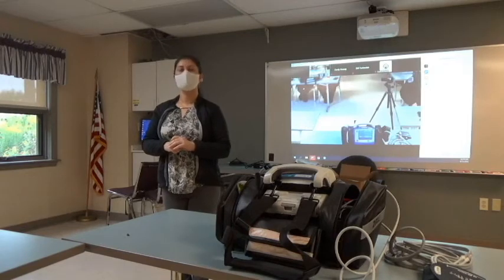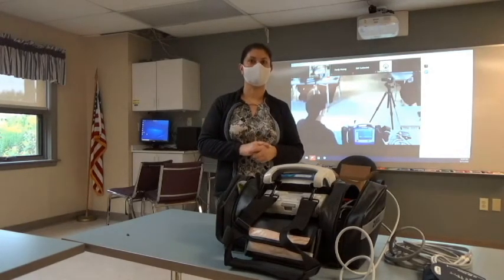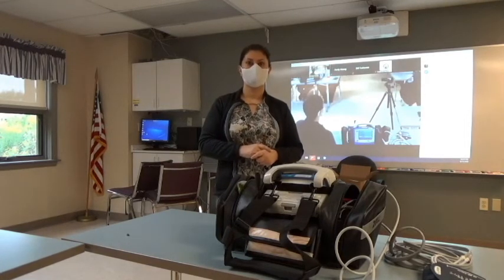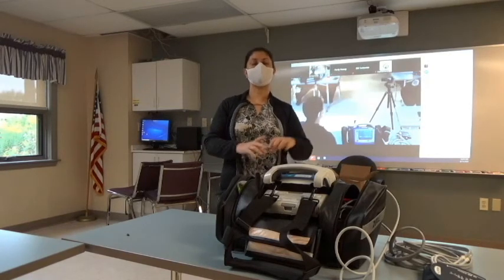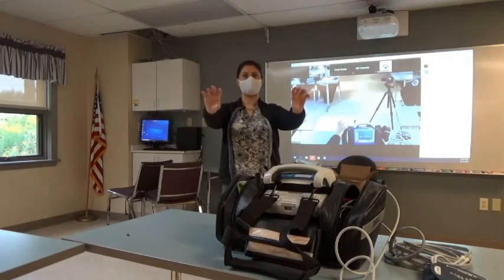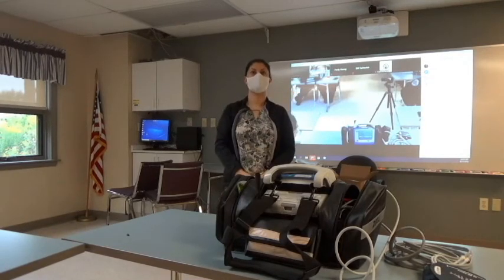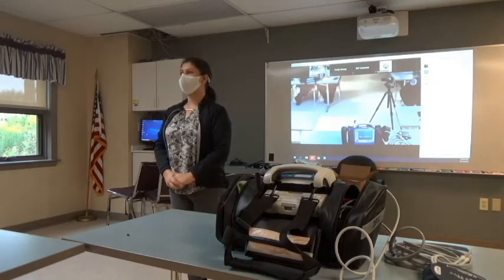No, I just wanted to note the way that you see it, or at least looking at their monitor, when you take a lead off, it doesn't change where it says mode, it still says demand, but above it, it's in blue, it says change to fixed. Correct. All right. Think of the bottom dash as your orders. Hey, this is what you're in, but the top is saying something came off. We're still doing it, but you should fix that. Correct. Yeah. Got it. Thank you. You're welcome. Any other questions at all?